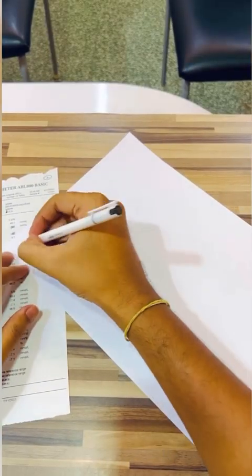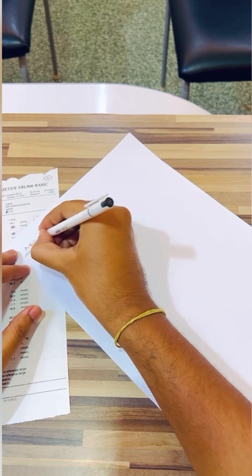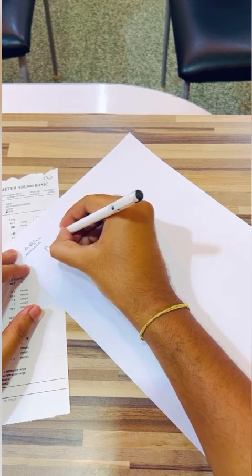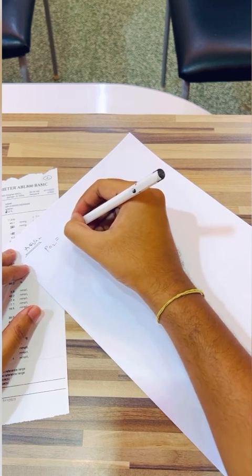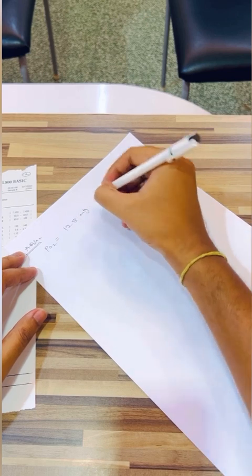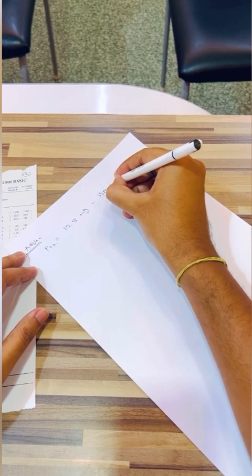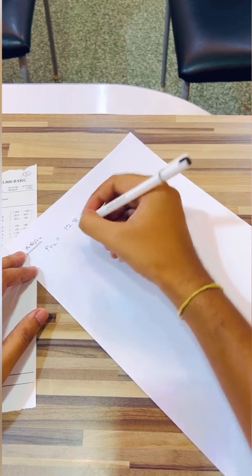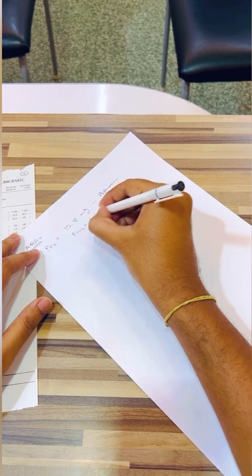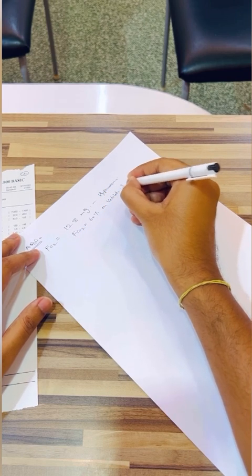So this is the second part of this ABG video. In this ABG, first we'll note down the PO2 of this patient. The PO2 of this patient is 128 mm mercury, which is a hyperoxemia, and the FiO2 of this patient is around 60% on the ventilator setup.